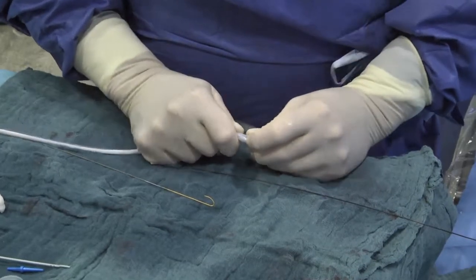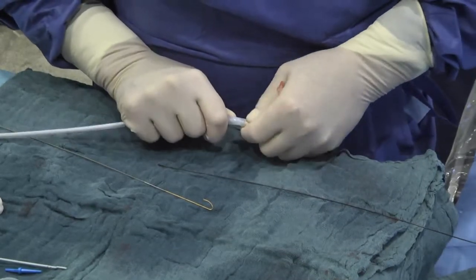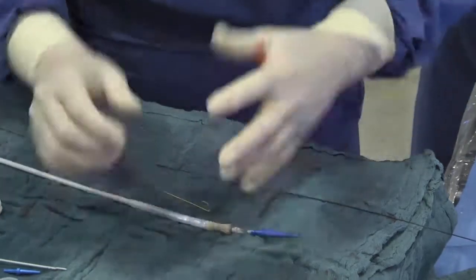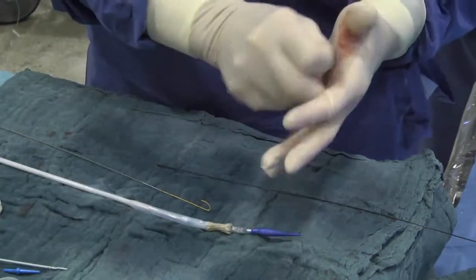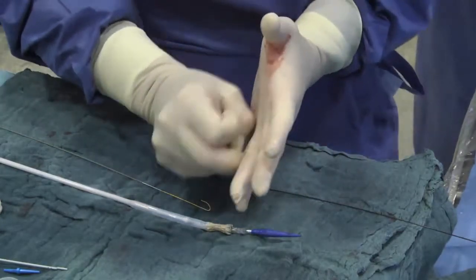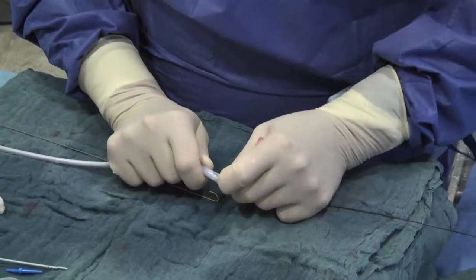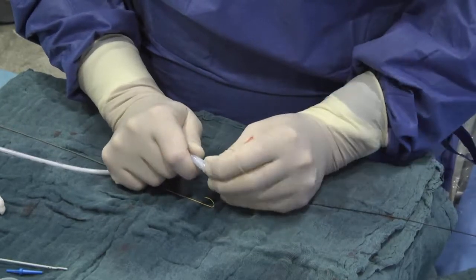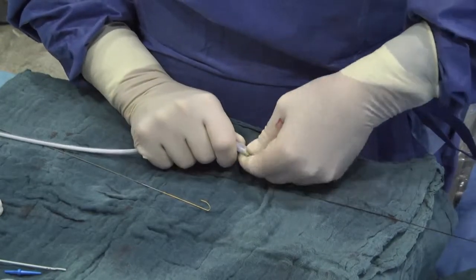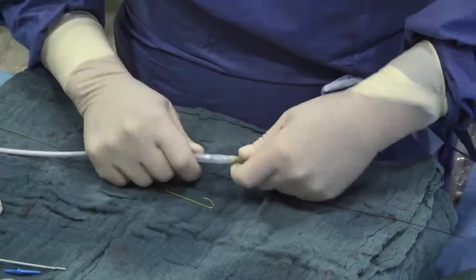So I was discussing the options. As I said, this can take time, but we can try the trick of Andreas with the 10 millimeter PowerFlex. And so I also will need an inflation device then to give some decent pressure. Of course, you will have understood by now that this is off-label use, but you don't come to the meeting to see on-label use. That's good. Thank you for telling us this.